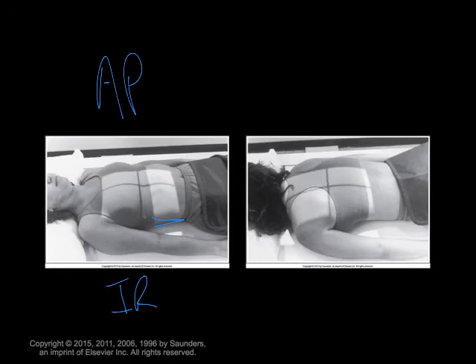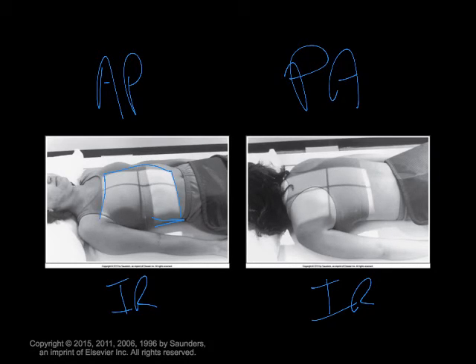Versus if the patient indicates that they have pain on their anterior surface, we will probably be doing our projection PA, again, in order to get that anterior surface closer to the image receptor. If they say they are hurting more on the lower side, we'll be shooting more low. If they say they're hurting on the upper side, we'll be shooting more high. And a lot of times rib series expect us to do this with the addition of sometimes a PA and lateral chest x-ray in addition to that.